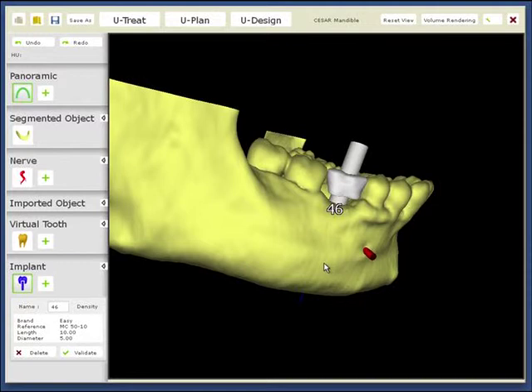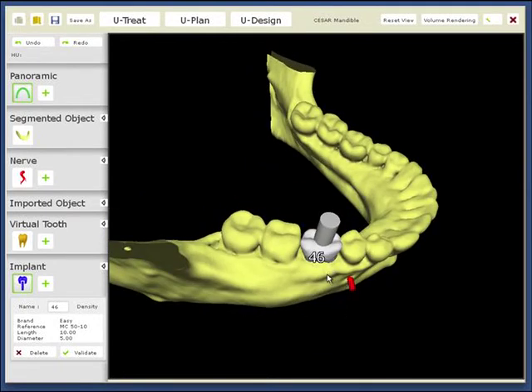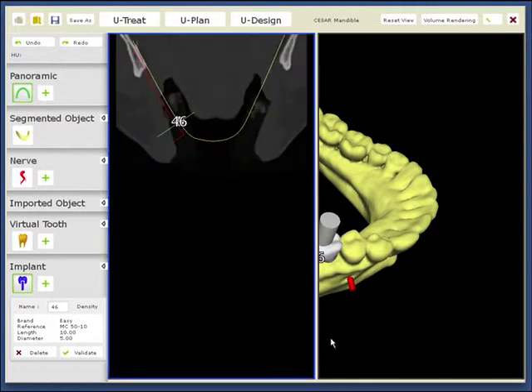Today, the UniGuide system is probably the easiest system existing on the market, and the fastest too, to do that job and to do it in a good way. The patient appreciates this, and the case acceptance is increasing dramatically when you are able to show these kind of things to your patients. So not only the security is coming for your patients, but also your reputation will increase because you are able to do that in a routine way.